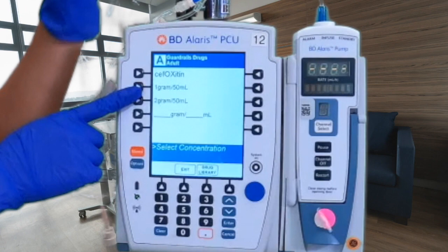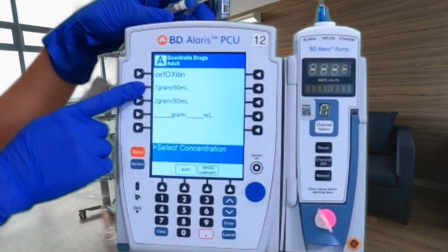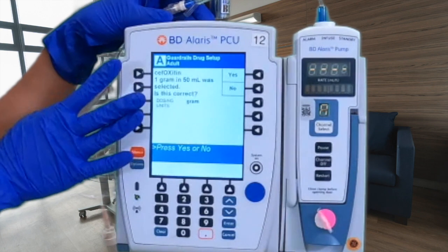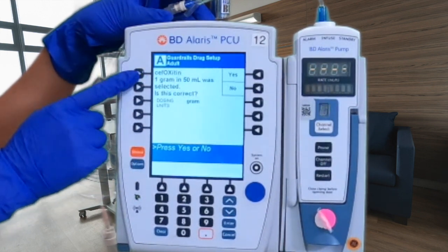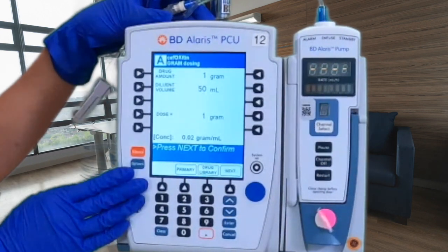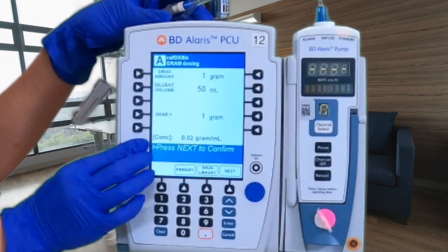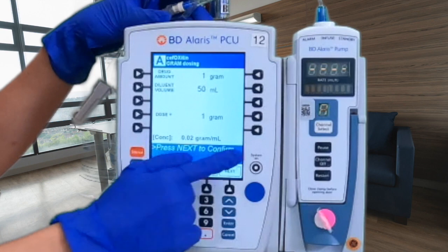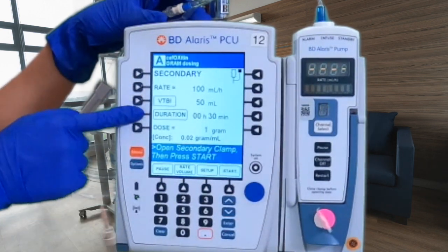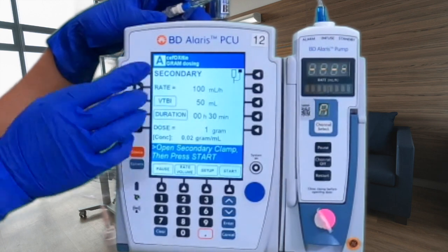We have one gram in 50 mL — always check your bag to confirm this matches what you'll be infusing. Press one gram for 50 mL. The pump will prompt: 'Cefoxitin 1 gram in 50 mL was selected — is this correct?' Press yes. At the final screen, confirm: drug is cefoxitin, dilution volume is 50 mL, dose is one gram, calculated concentration is 0.02 g/mL. Press next — duration will be 30 minutes.